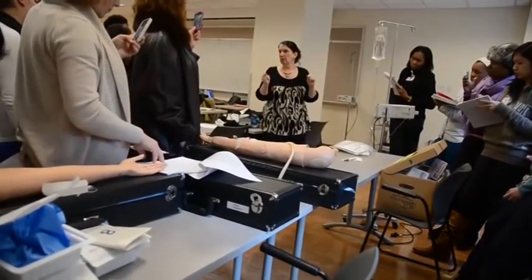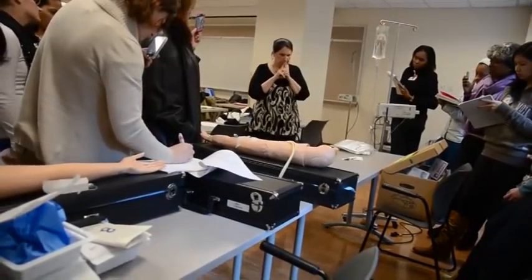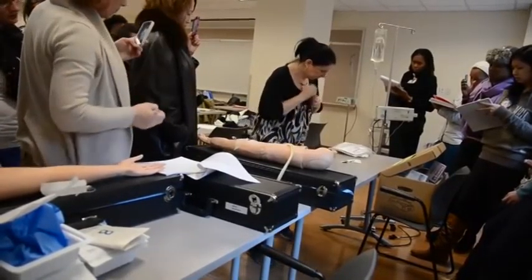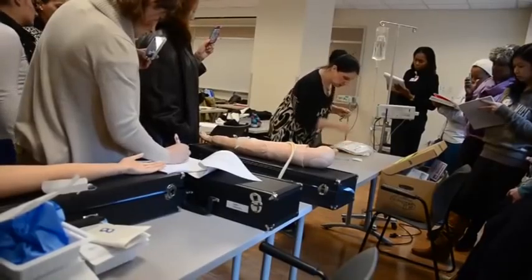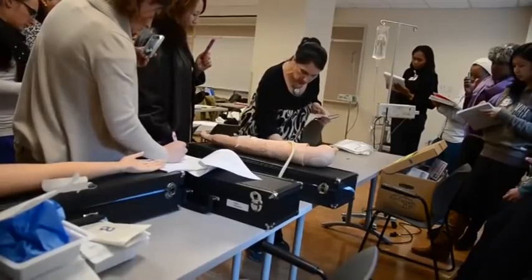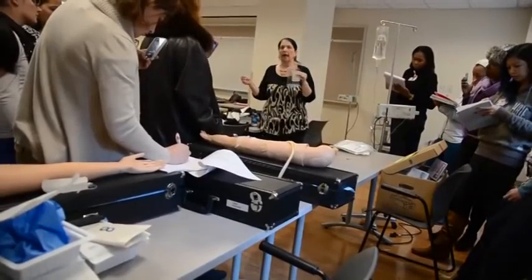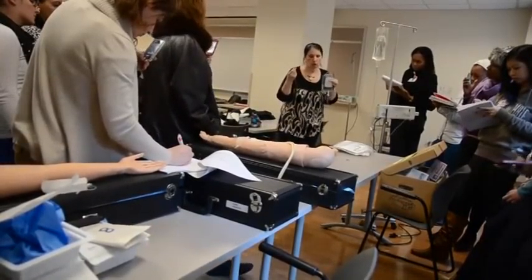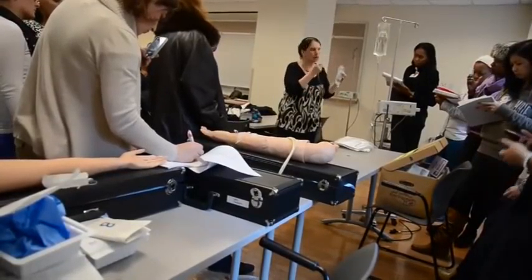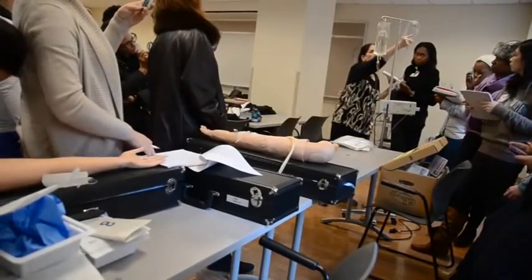Now I want to do an IV piggyback for a patient who already has an IV. So now what do I need? I need the hook. I need secondary tubing — I don't need primary tubing. I need the short secondary tubing. I don't need the long tubing. If you pick the long tubing, you could use it, but it's too cumbersome because of where I'm going to put this. So I want to get this out of my hands, put it up here, and label it.